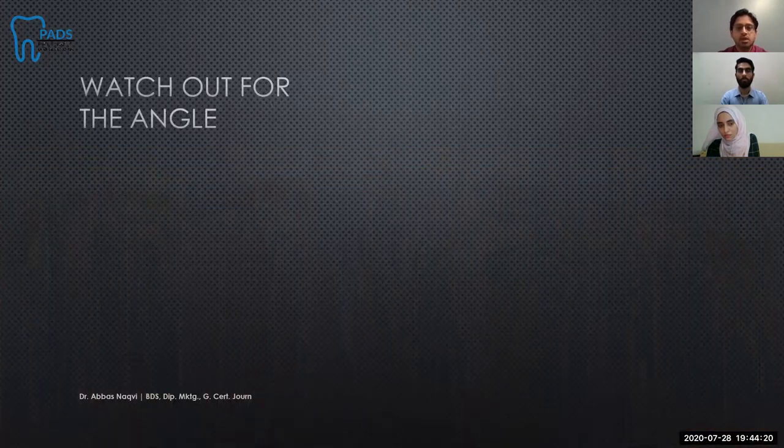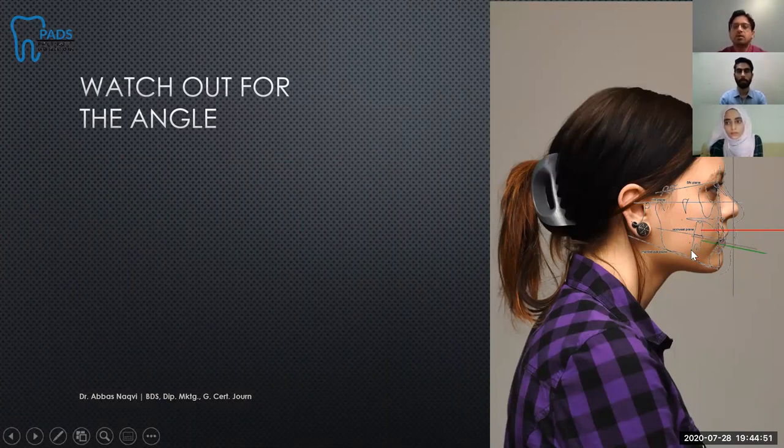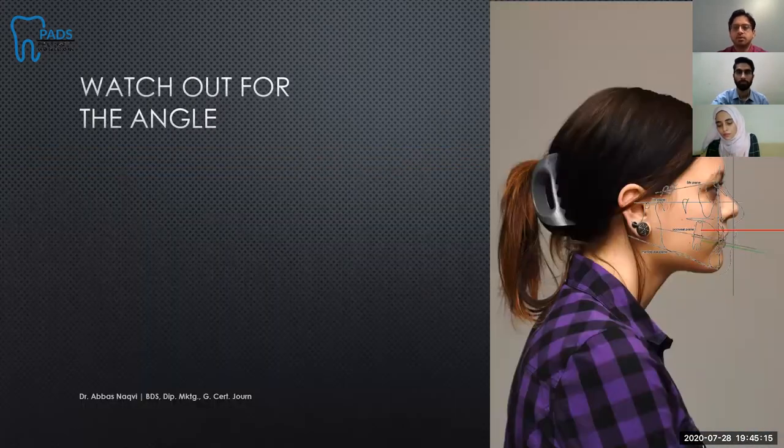We'll talk about that. So just adding to the angle aspect that I just mentioned, you see, this is roughly how the face is organized. And this is the facial plane. By nature, we tend to photograph things perpendicularly, which is perpendicular to the facial plane. But please note that the occlusal plane is at an angle. So you have to be parallel to the occlusal plane. Here, you have to be on this green line, not on the red line. If you are on the red line, you will get the picture on the left. And if you're on the green line, you'll get the picture on the right. Okay, is that clear? Red line, picture on the left. Green line, picture on the right. This is what you want.